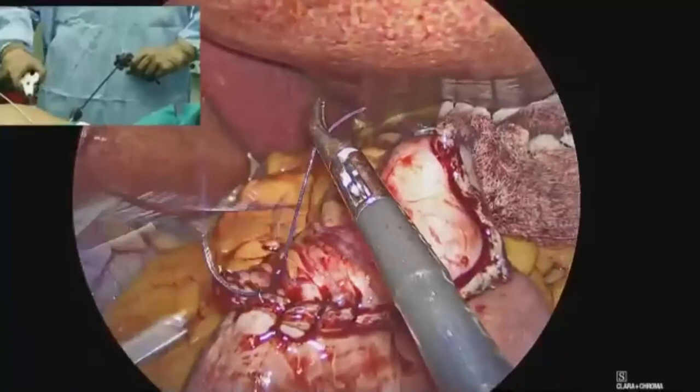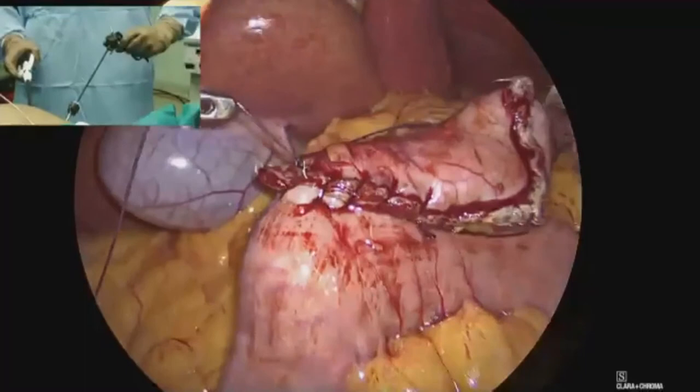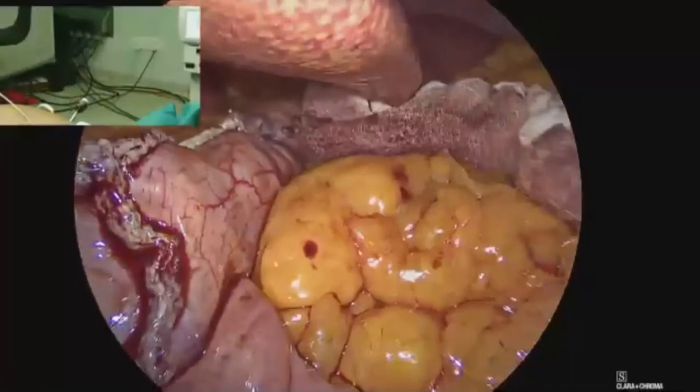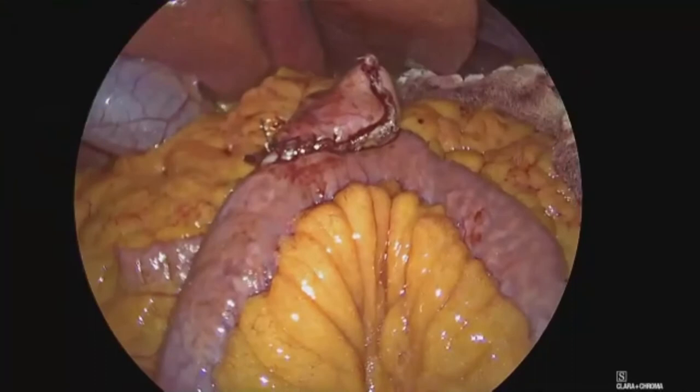So this is done. The mini bypass is over. We never close internal hernia defects in our mini bypass because we never had an incidence of internal hernia in about 4,000 cases done. I'm going to do an endoscopy, and then I'm going to shift myself to the studio for discussion on what we did.